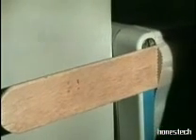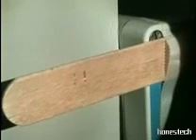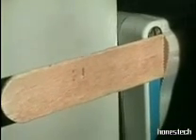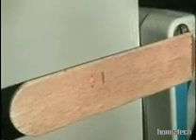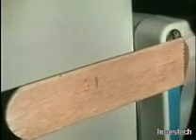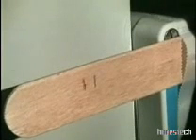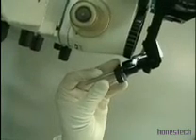Thanks to the AcuBlade, irregular incision lines don't occur, unlike those yielded with the micropoint. The swift beam sweep along the line reduces the operating time. Because the sweeping speed is constant, the energy distribution is uniform along the entire length of the line. The AcuBlade can either be used with an operating microscope or a handheld device.